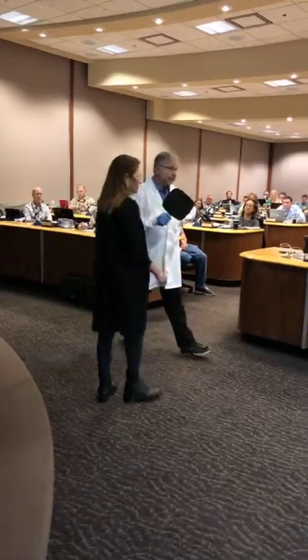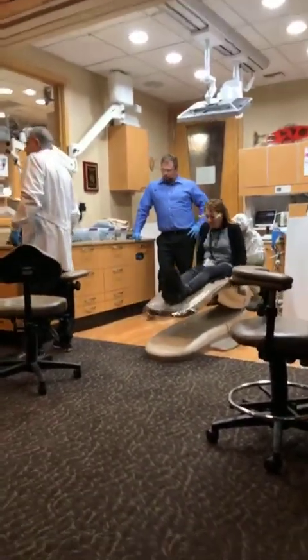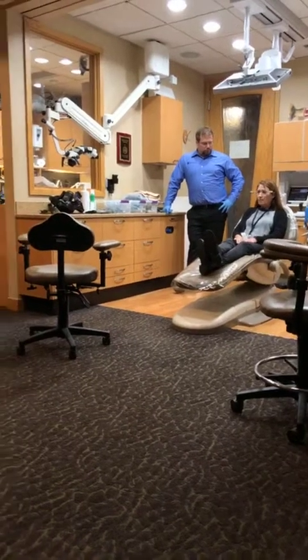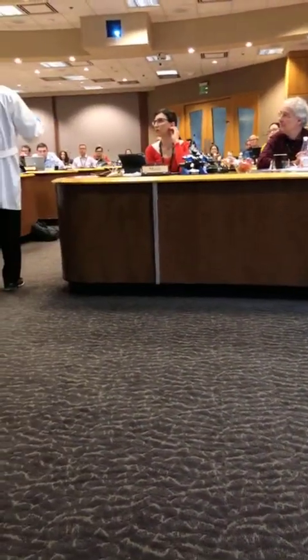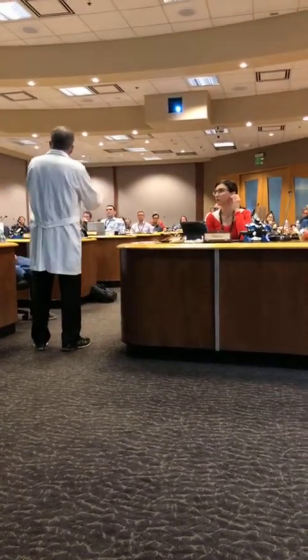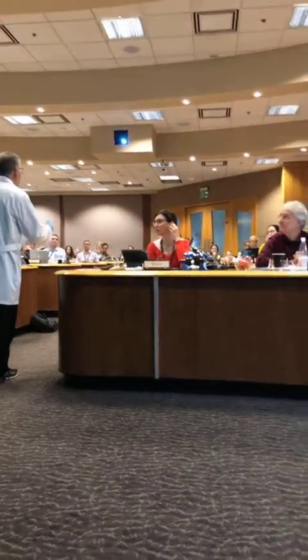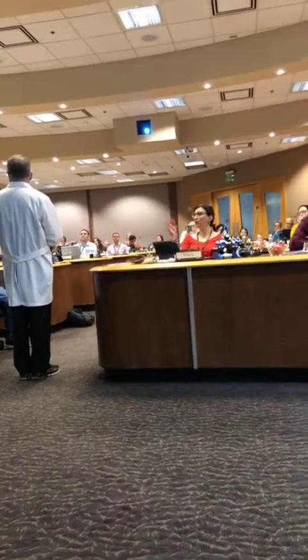Once the glasses are on the head while the patient is standing, they're ready to sit down. To expedite the exercise, my recommendation is to put the glasses on before you become the patient. Some of you will be milling around while one person takes photos and one is the patient — be more productive by sticking the glasses on, getting them level, and locking them in the back of the ears.